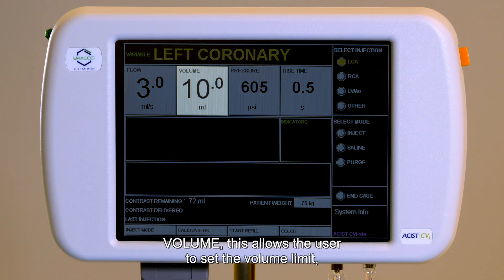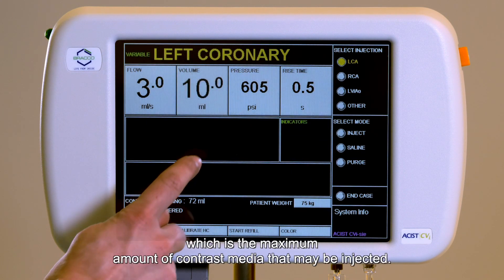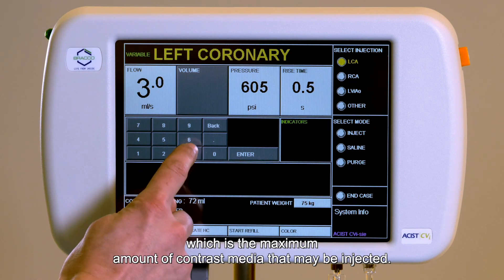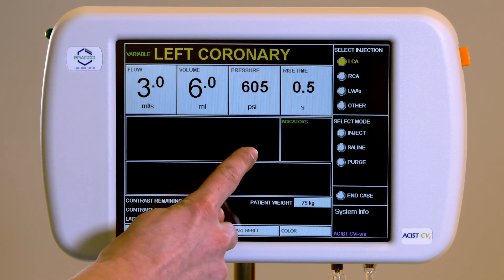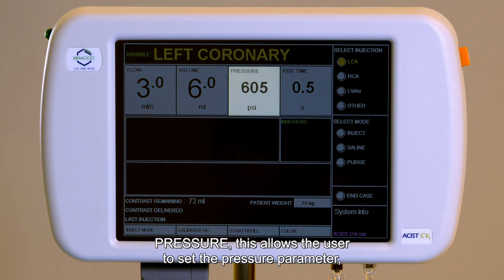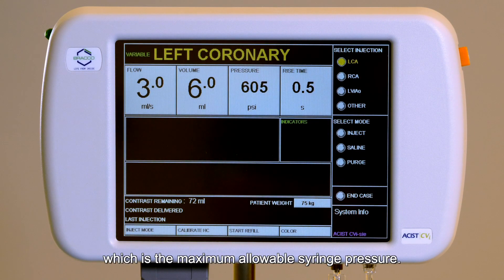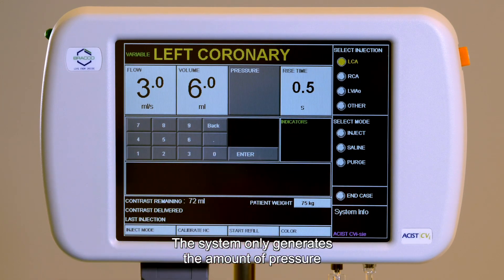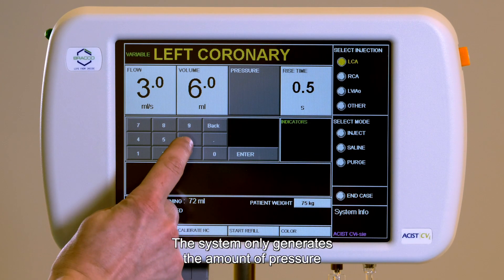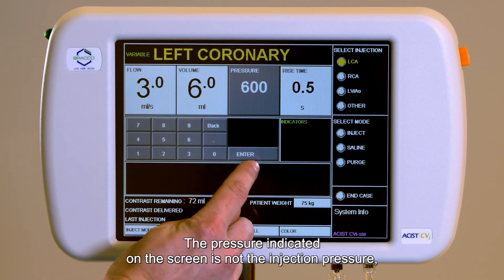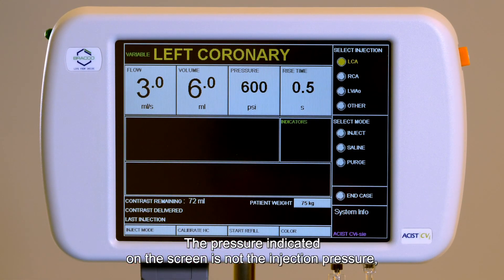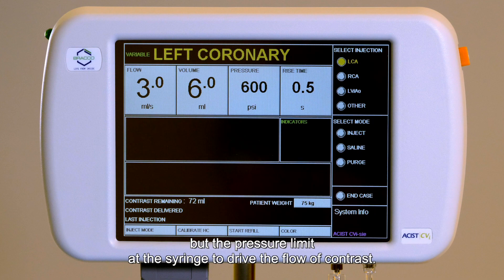Volume: this allows the user to set the volume limit, which is the maximum amount of contrast media that may be injected. Pressure: this allows the user to set the pressure parameter, which is the maximum allowable syringe pressure. The system only generates the amount of pressure necessary to create the flow requested, no more. The pressure indicated on the screen is not the injection pressure, but the pressure limit at the syringe to drive the flow of the contrast.